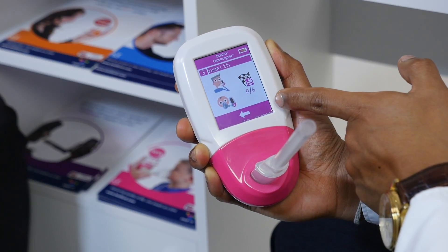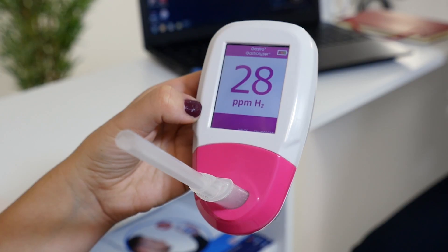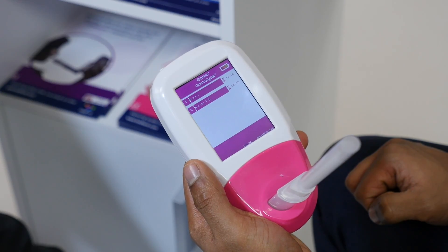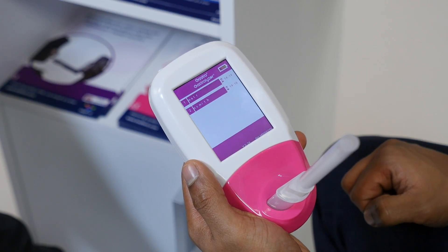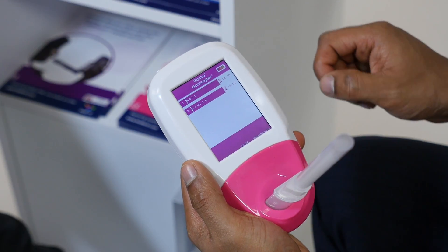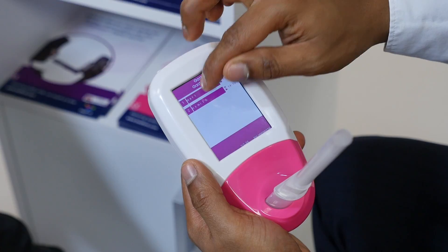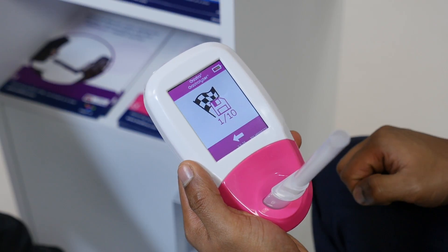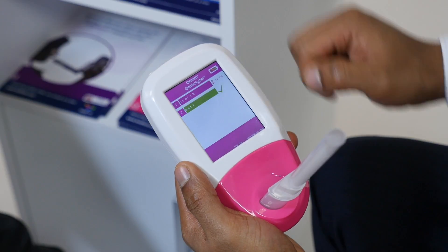You will then be on the profile for the next patient. Click on the breath test icon and repeat the process. If you need to finish a patient's test early, once you are in the protocol countdown screen, click on their name and click the save icon, then click the save icon again to confirm.